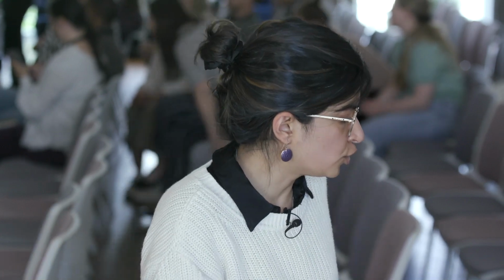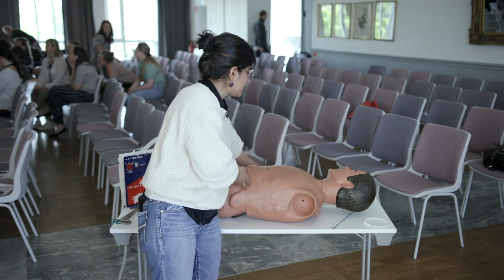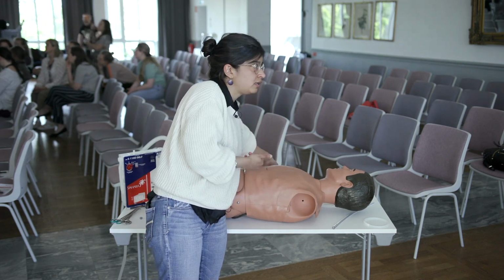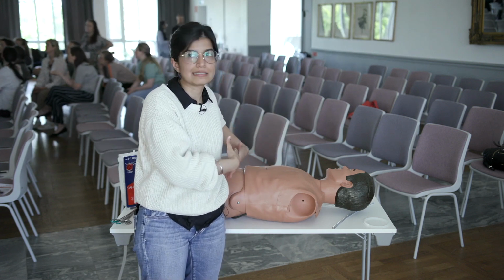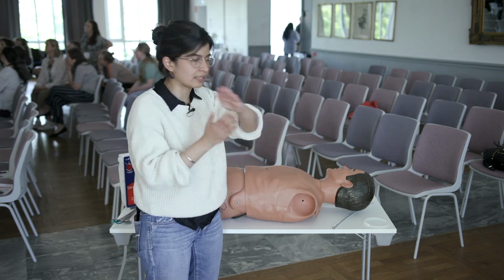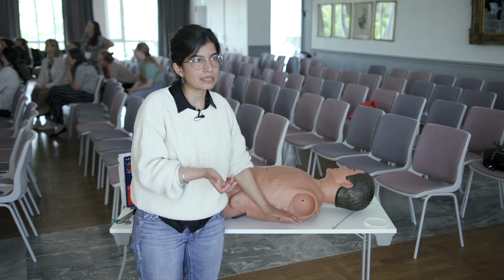So depending on where the effusion is, if it's loculated, if it's free-floating, if it's simple, complex, and so on, you can position your patient in different ways for that. The two common ones are supine like this, and I put a little buffer on the other side, like a pillow or something that topples them. That way the effusion is in the most dependent area and you have a bigger effusion. Or you can have them up at like a 30-degree angle, and that way again it will layer posteriorly.